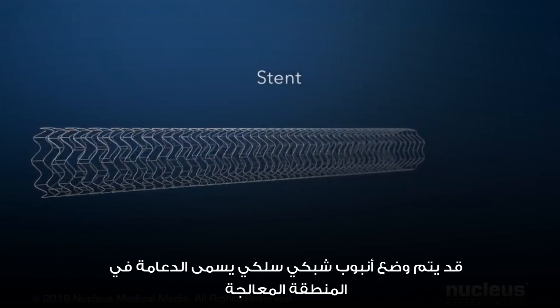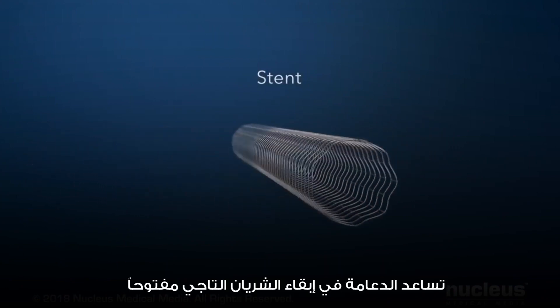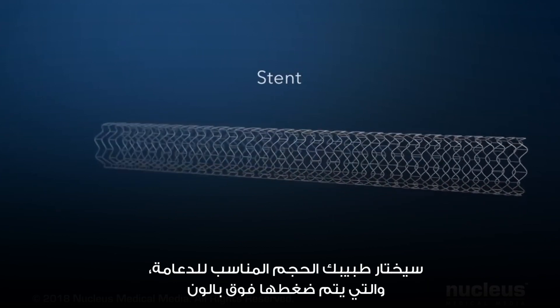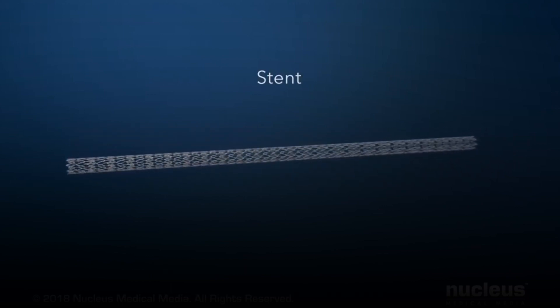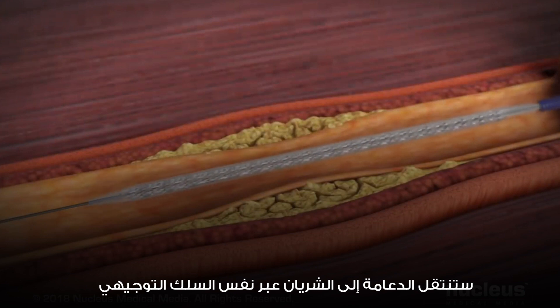A wire mesh tube called a stent may be placed in the treated area. The stent helps keep the coronary artery open. Your doctor will choose the proper size stent, which is compressed over a balloon. The stent will be moved into the artery over the same guide wire.